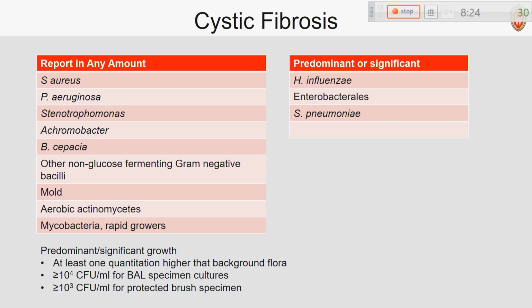What's your record for the number of isolates you've reported out on one of those? I want to say my record has been about 7 or 8 at one time. We have a lot of restreaks for cystic patients, just because there's so many things we have to work up in them, and a lot of it isn't necessarily mixed flora. Okay. All right. Thank you.